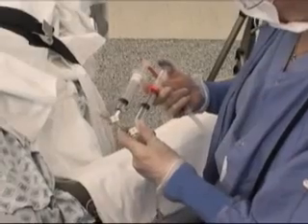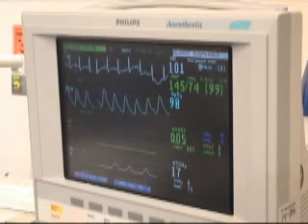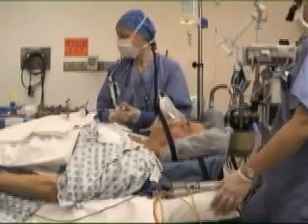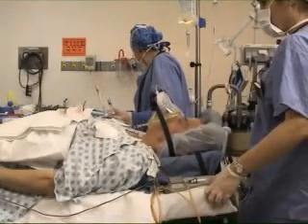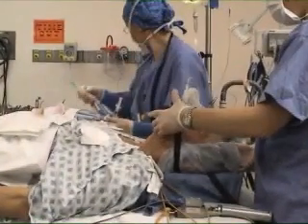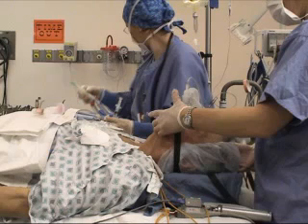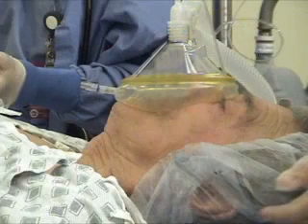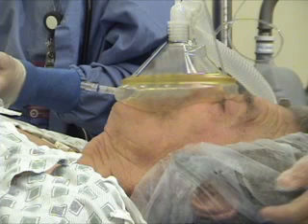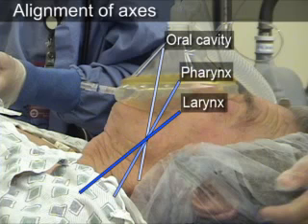Obtain intravenous access and place the patient on a monitor if time and conditions permit. Assign an assistant to watch the monitor during the procedure and report any changes. Adjust the height of the bed so that the patient's head is level with the lower portion of your sternum. Unless contraindicated, place the patient into the sniffing position by placing a pillow or folded towel under the patient's occiput. This combination of flexion of the neck and extension of the head improves the alignment of the axes of the oral cavity, pharynx, and larynx, facilitating optimal visualization of the vocal cords.